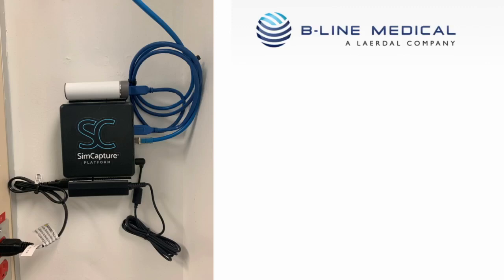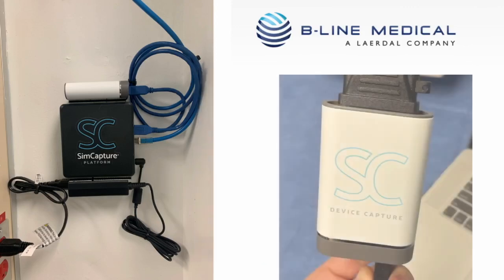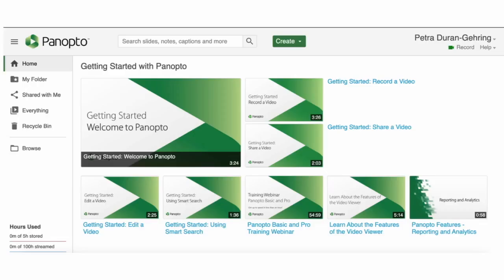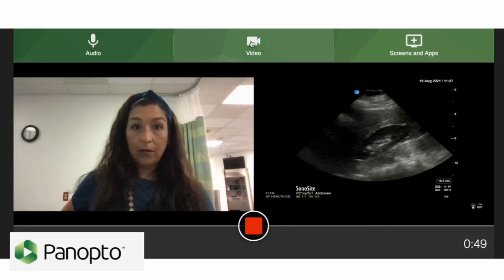So when you use it for simulation, it allows you to enrich your simulation experience by incorporating video. But in our case, we channeled MacGyver, and we literally took the video converter box off of the Sim Center system. And we were able to cannibalize it and attach it to our ultrasound machine and computer, and voila!